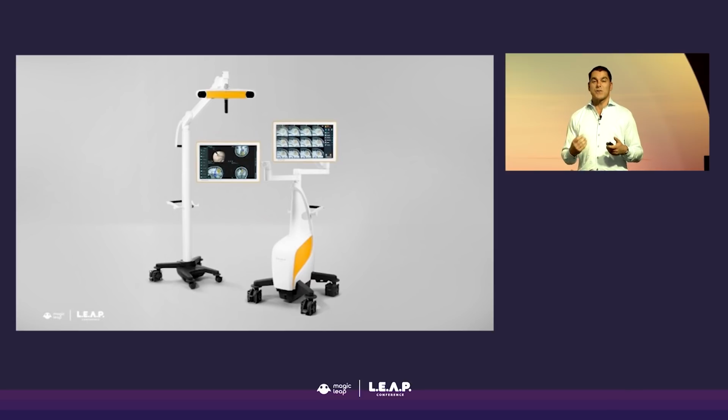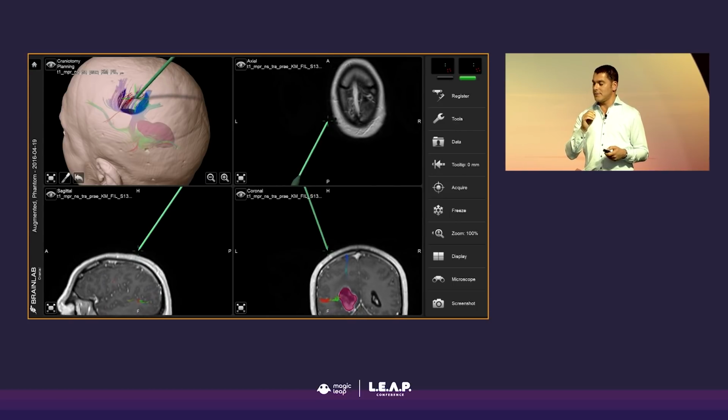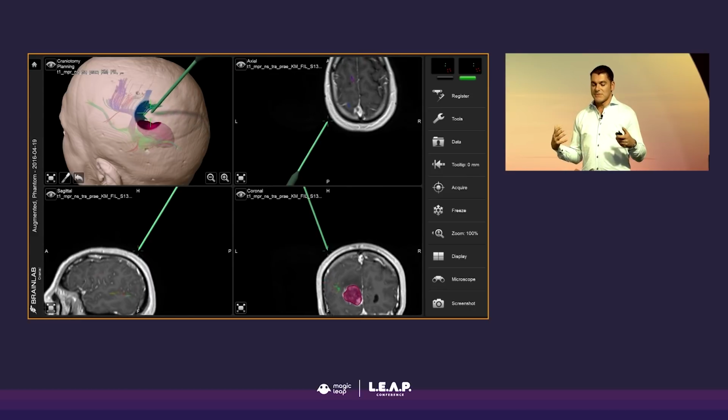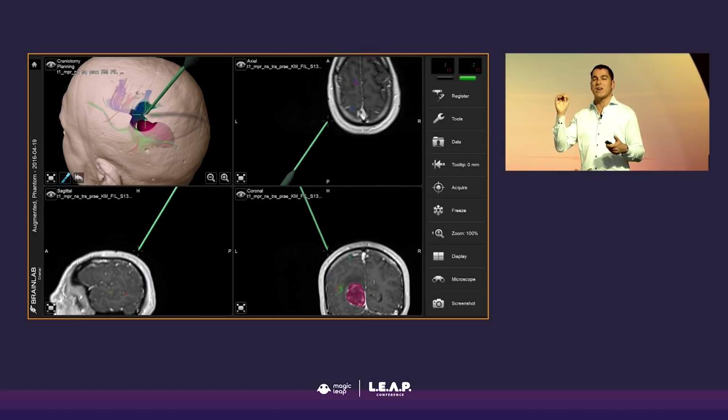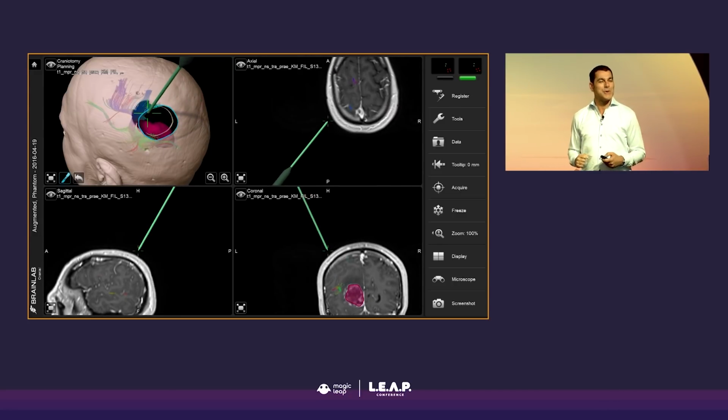And by tracking the positioning of an instrument, we allow surgeons to get the perfect opening of the skull just above the tumor and to simulate on the fly the perfect location and shape of your craniotomy and safely access the tumor, pass by critical structures. By tracking the tip of an instrument, we can gradually digitize the different steps of surgery, and or use an instrument that we want to align along a predefined pathway. This looks like a computer game, doesn't it?